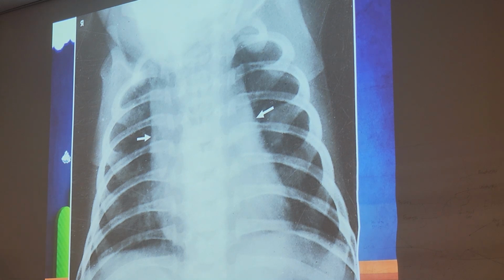Just for review, guys. If I point up here, what is this specifically? Left apex. Down here would be the right costophrenic angle. If I'm talking about landmark on the lung, this is the right base. I'm talking about lungs right now, not ribs. If I'm pointing to this area and saying, what's the muscle? You would tell me this area the arrows are referring to as the what? Very good.